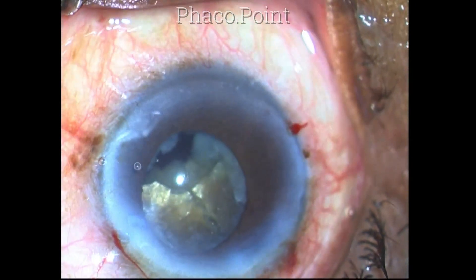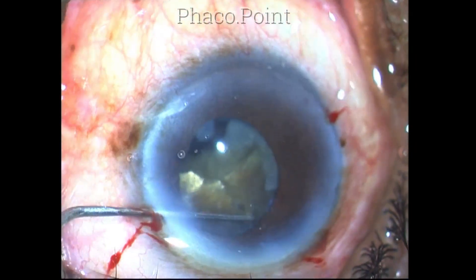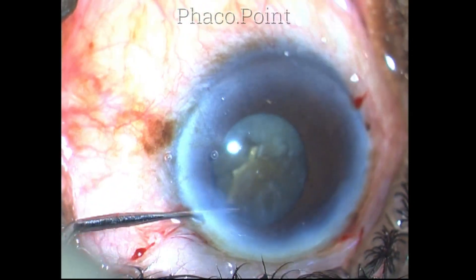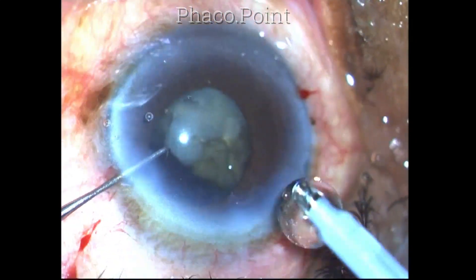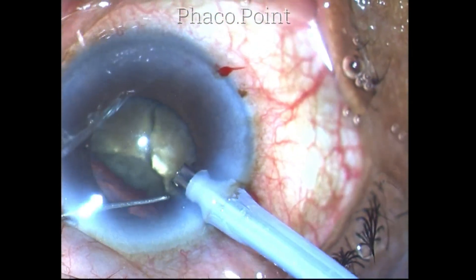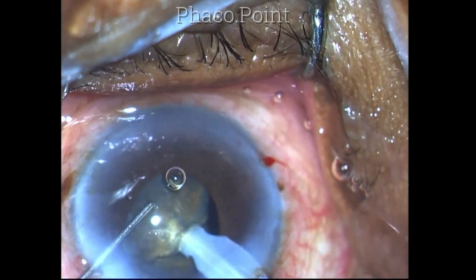At this point I take a break and insufflate more methylcellulose, which is a viscous agent with dispersive properties that will coat the endothelium much better than sodium hyaluronate. However, it is less effective than chondroitin sulfate because chondroitin sulfate tends to stick to the endothelium whereas methylcellulose will not. That said, methylcellulose will not be aspirated en masse like sodium hyaluronate and therefore tends to stay longer within the anterior chamber.